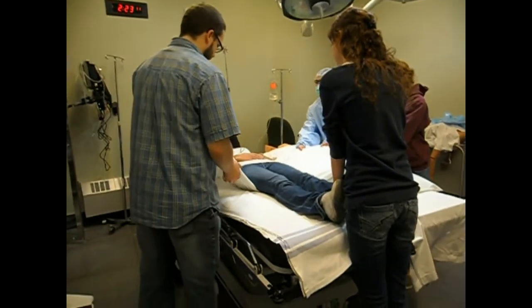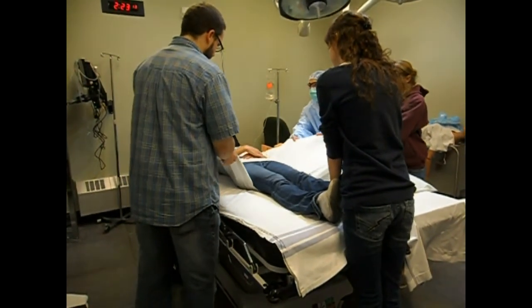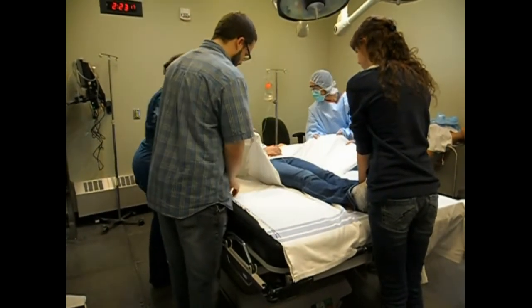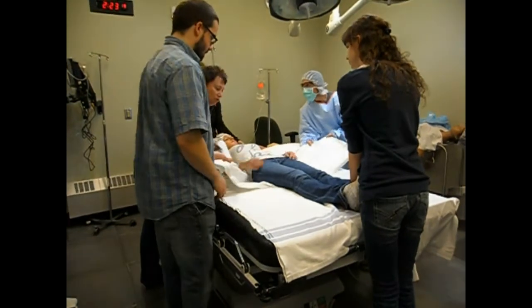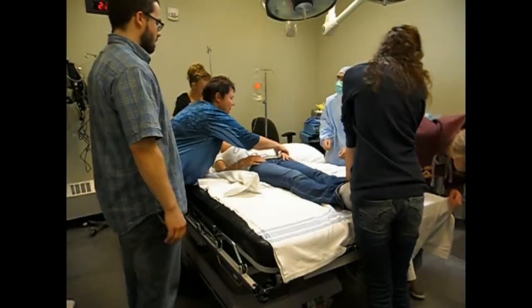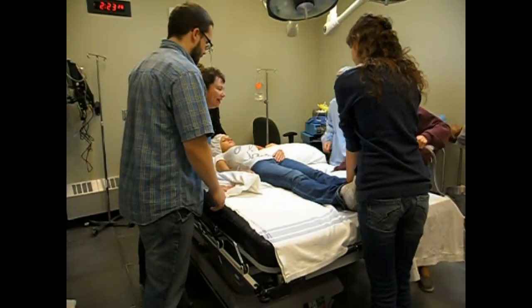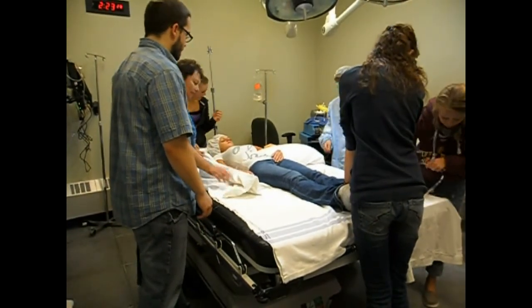And so she's asleep now. And so we're going to just do a straight lift just to the edge. Right here. Okay. There. Okay, now we no longer want to use the draw sheet. So you guys are going to just tuck that draw sheet down by the side. Now how are we doing with the catheter there and the IV? What do you think? All right.